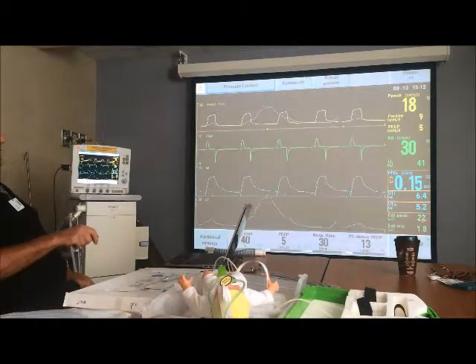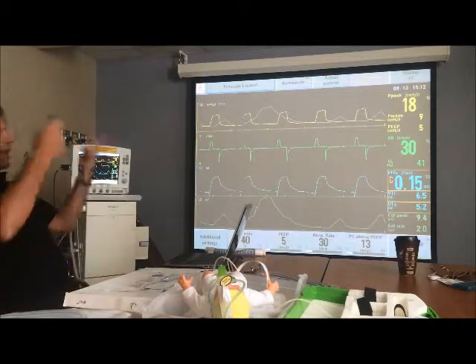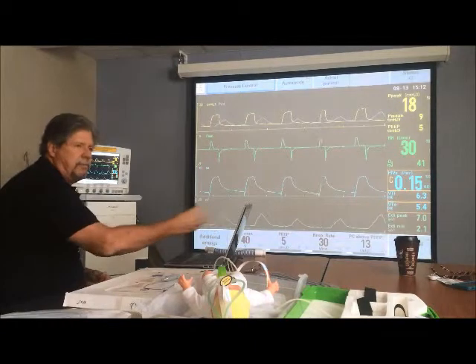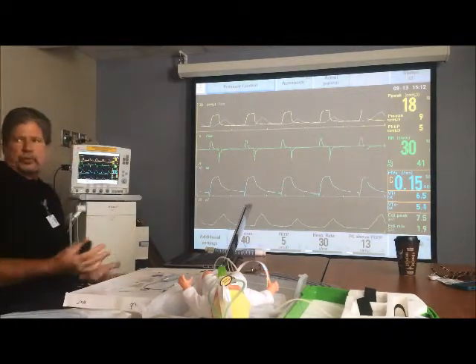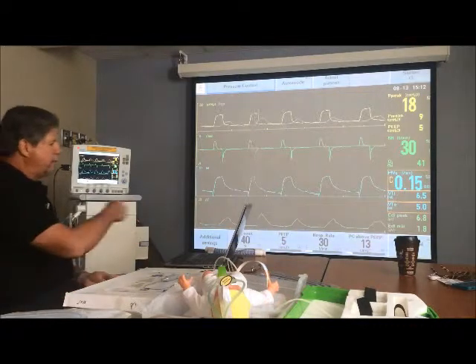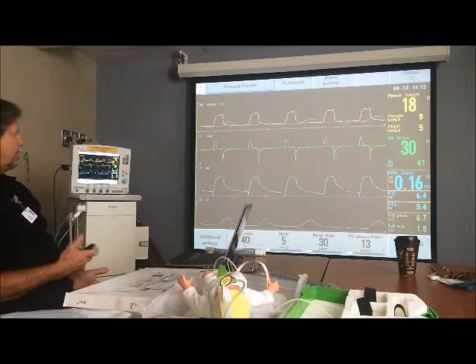And there was an EDI of 22. That's when the patient took a real deep breath, so his EDI went up, right? The ventilator didn't even capture that. But in real life, the ventilator would have captured that because it was such a negative pressure probably to do that. But remember, it's just the simulator. So you go, holy cow, we're really asynchronous.